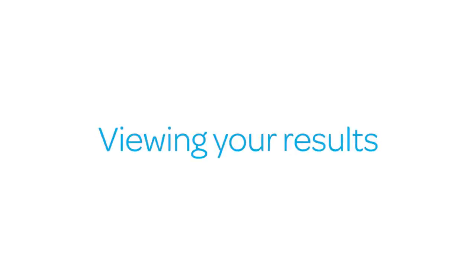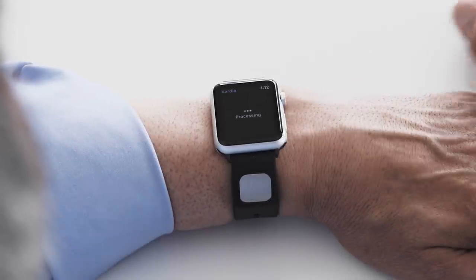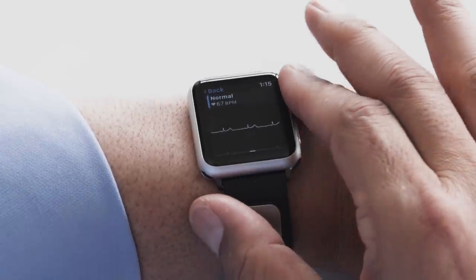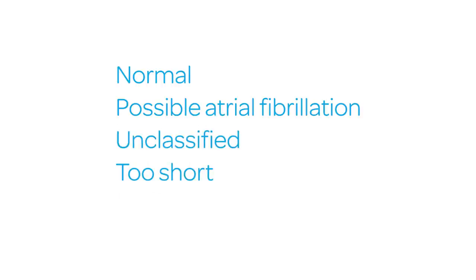Viewing your results. Once it's saved, your ECG will be analyzed and the results shown on your Apple Watch. Swipe to the right or use the digital crown to view your entire ECG recording. Here are your possible recording results: Normal, Possible atrial fibrillation, Unclassified, Too short, Unreadable.